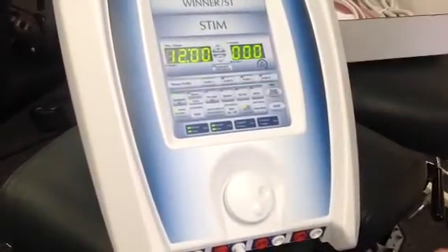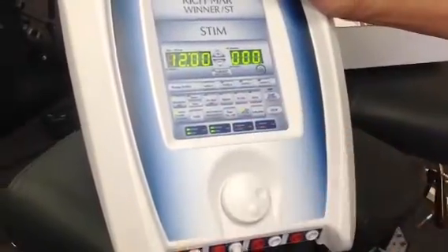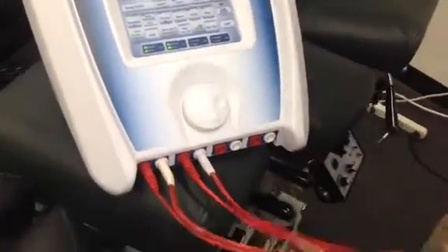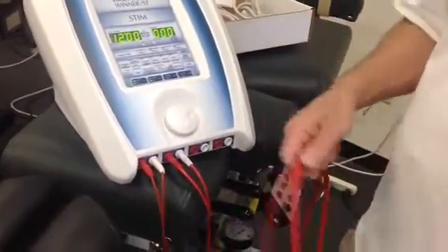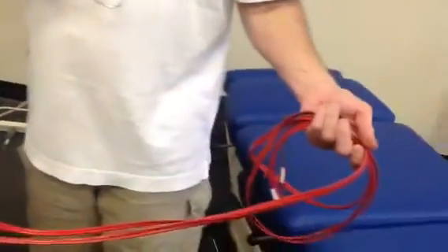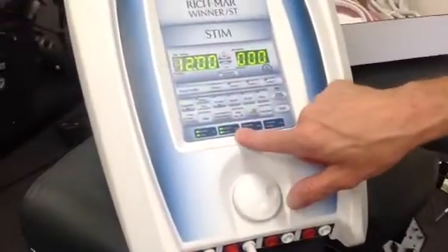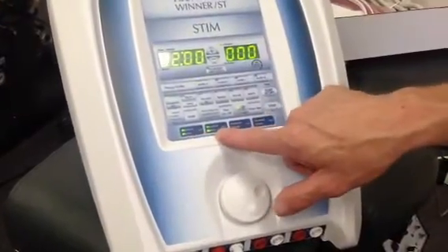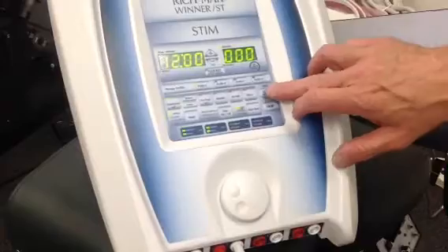It's very easy to program. And notice we're plugged into A and B, so we're going to channels 1 and 2, I should say. We're going to assume that the cords have the electrodes on and they're on the patient right now. So we're going to come over here and choose Profile A. It selects channels 1 and 2, and we simply turn up. We have to push our start.